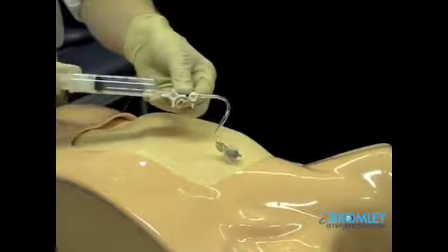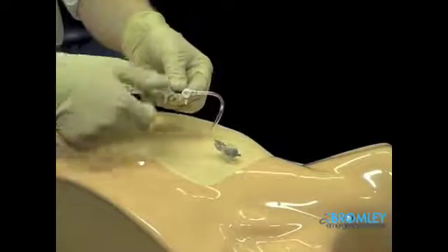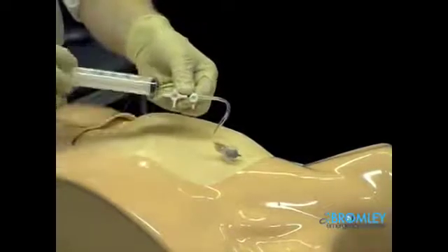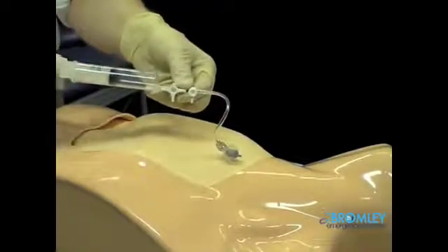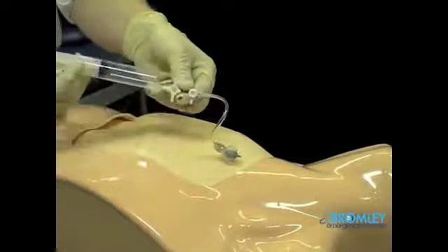It is important to attempt to remove as much air from the pneumothorax as possible. If it becomes difficult to withdraw back on the syringe, this may be a good indicator that you have removed as much air as is possible from the pneumothorax.